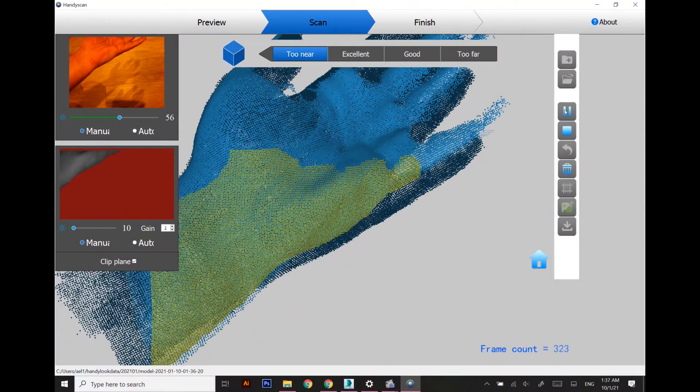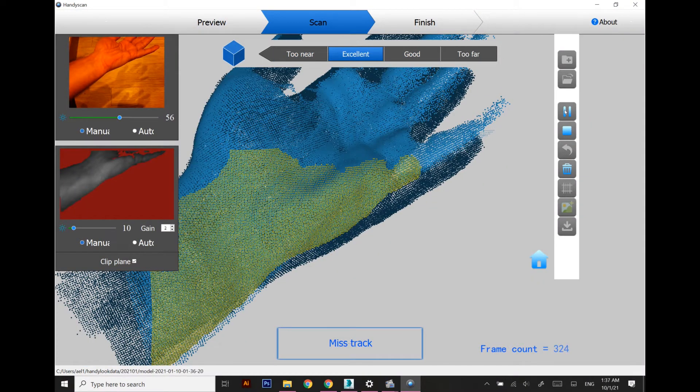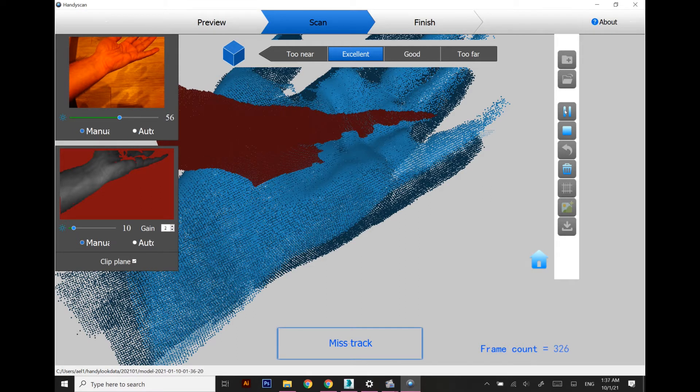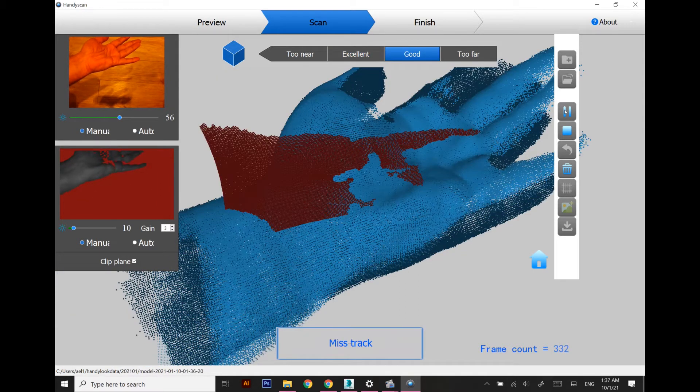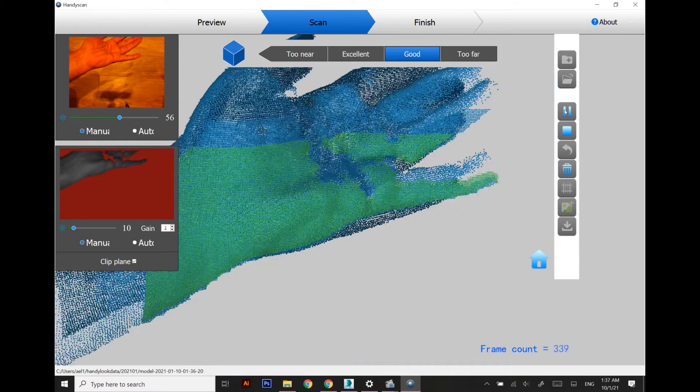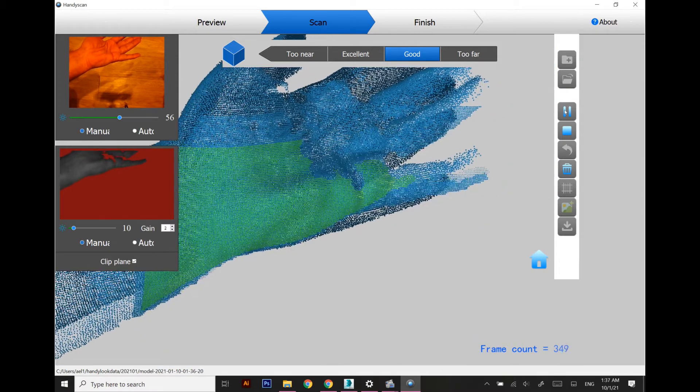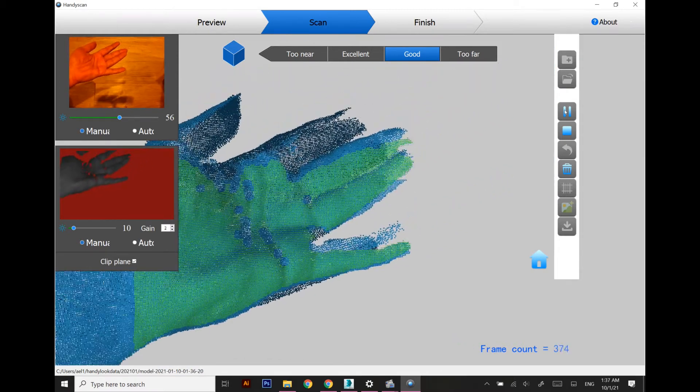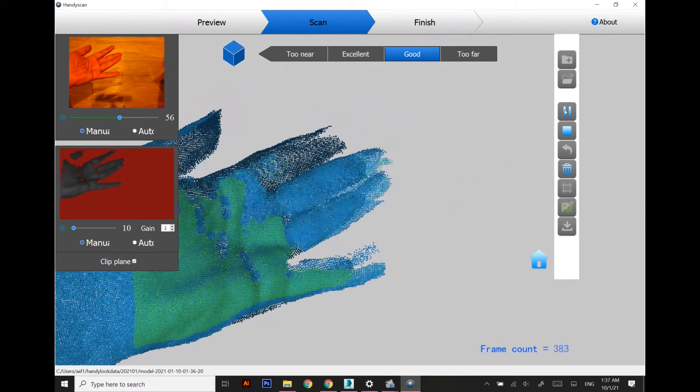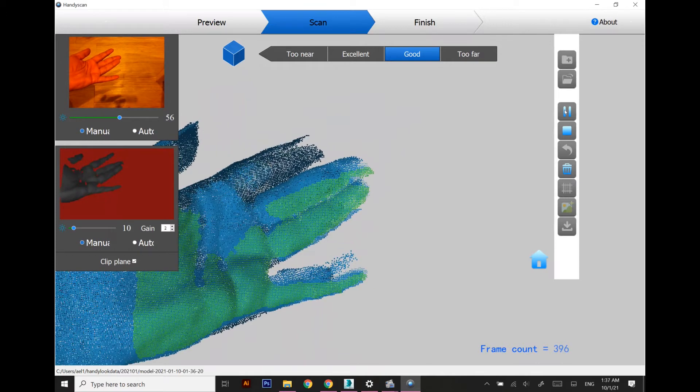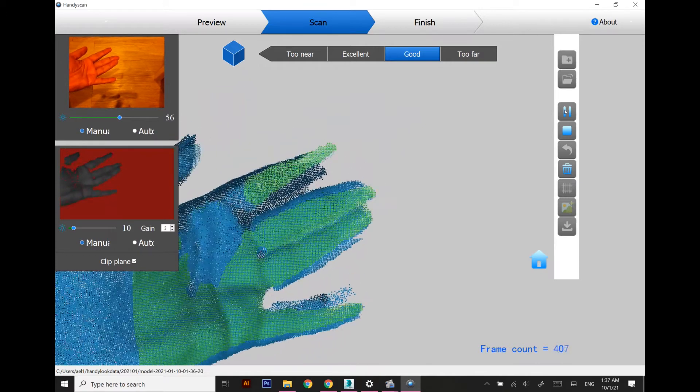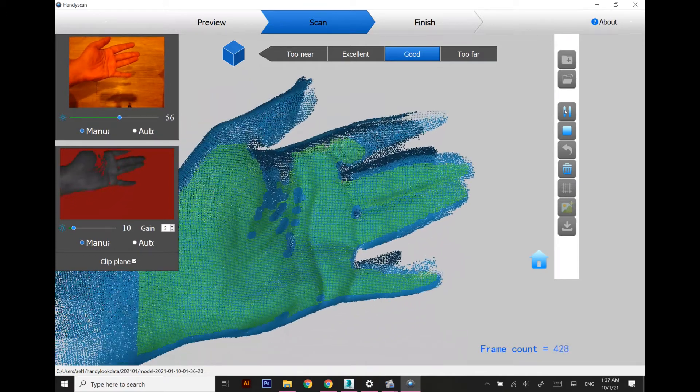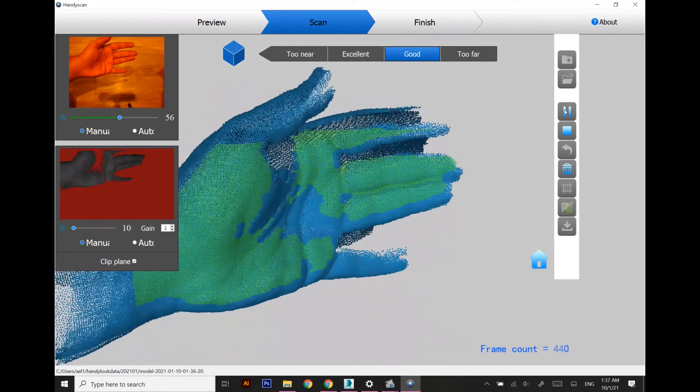Right now we are not interested in scanning the fingers area because we are going to use the splint or braces just for the wrist area.